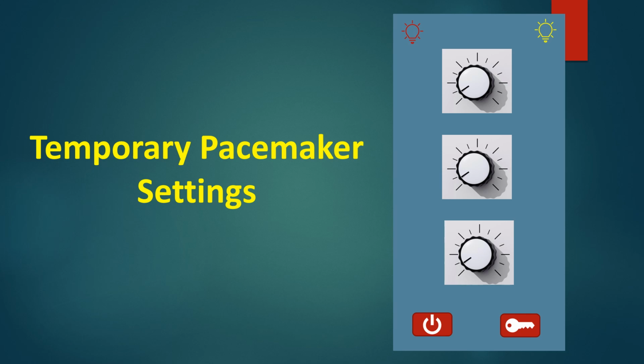The controls and buttons shown here are symbolic and vary between different models of the pacemakers. Some pacemakers have a display of the modes and parameters in addition. This description is on commonly used single chamber temporary pacemaker. Dual chamber temporary pacemakers will have additional controls and displays.